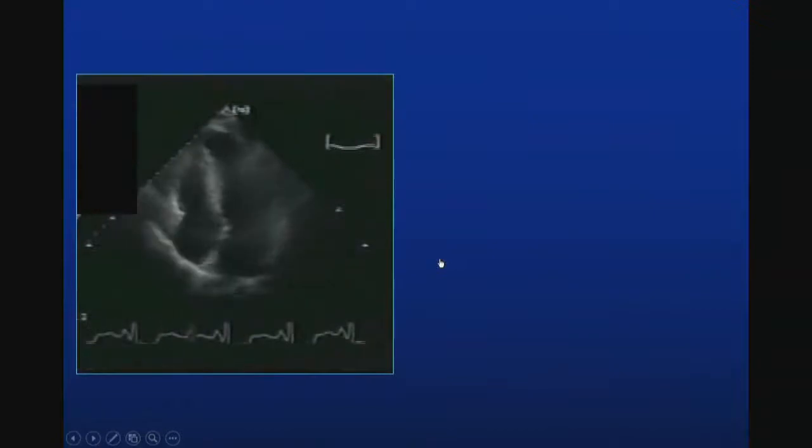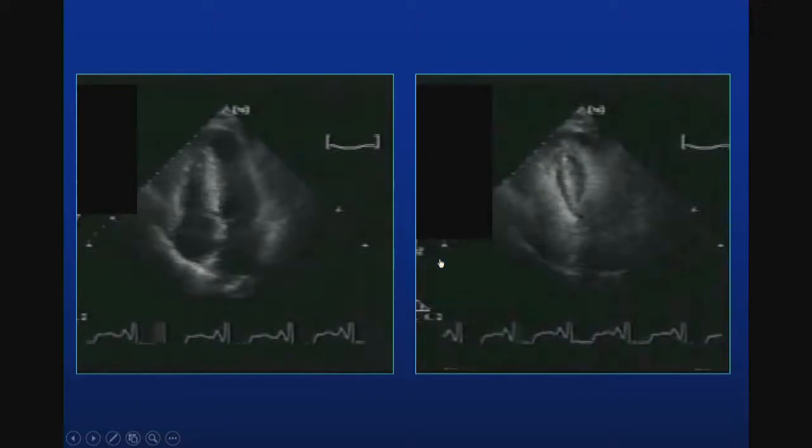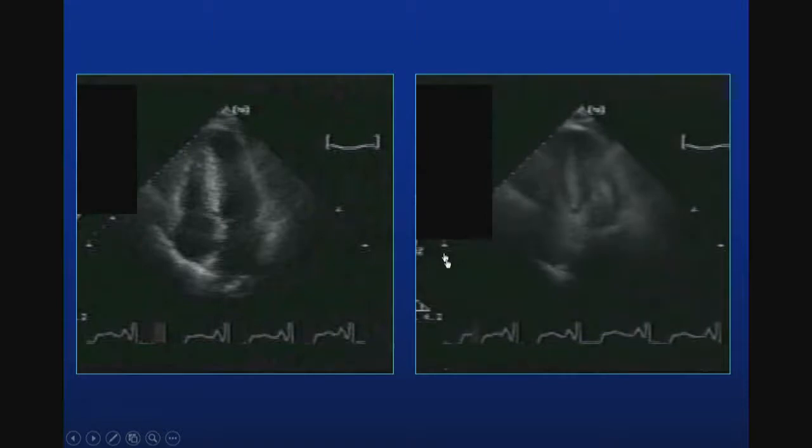All right, what can you tell about this heart? I can tell that it's most likely quite vigorous. That's the only thing I can tell. I cannot tell the thickness of this heart or anything else. And actually, this is a hypertrophic heart with hypertrophic cardiomyopathy. If you take a look at that, the septum is quite impressively thickened, maybe even with small trapping of the apical chamber, and certainly very hyperdynamic.